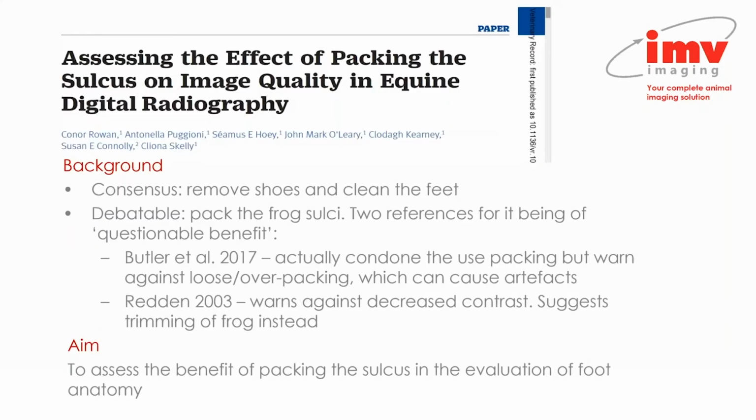In this final study, assessing the effect of packing the sulcus on image quality in equine radiography. Now, the background to this, there is a consensus that for good radiographs of the foot, the shoes should be removed and the feet should be cleaned well. They report that it is debatable that the frog sulci should be packed. Now, they provided two references for it being of questionable benefit.